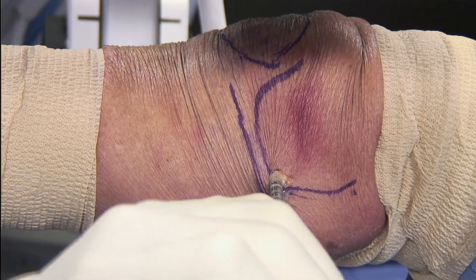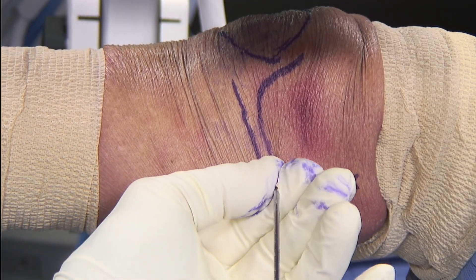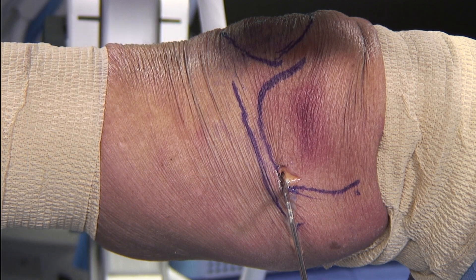I like to back out the reamer manually to avoid any loss of our position. Image intensification is then used to confirm that our guide pin is still in position after performing the core decompression.